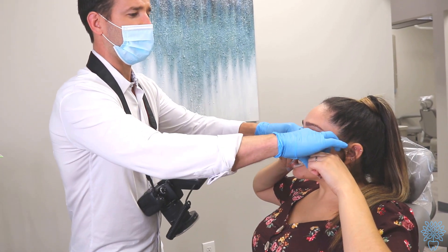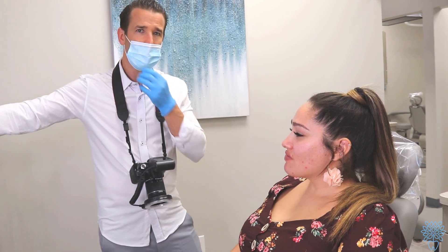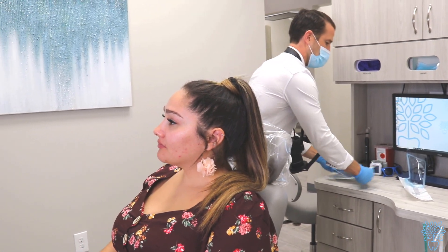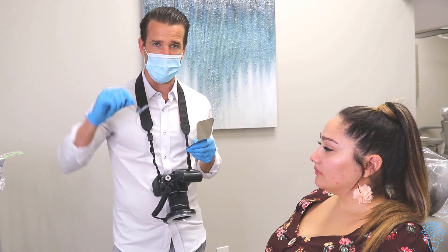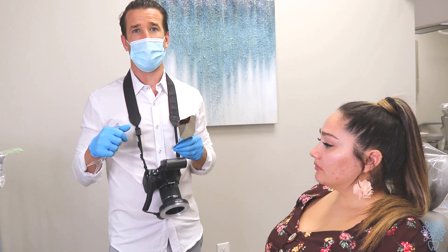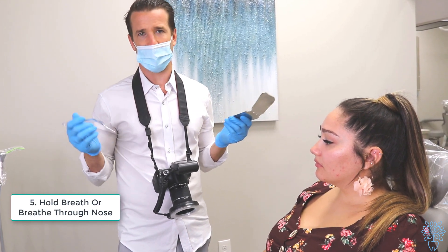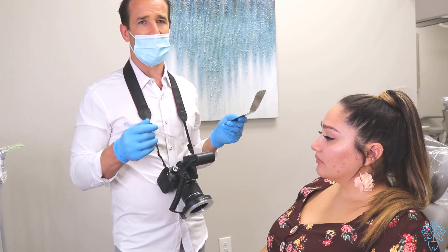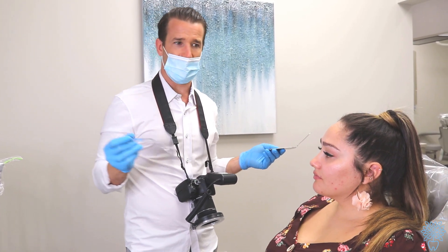Now we have the top and bottom pictures. Most people think this is the toughest because you have to use a mirror. We have another instrument to hold the lips away, and then we have the mirror. I always explain to the patient what we're doing. We either have them hold their breath or breathe through their nose so the mirror doesn't fog up. If it's going to be quick, I'll say 'hold your breath — it takes two seconds.' For the top, the mirror goes like this; for the bottom, it goes like this.